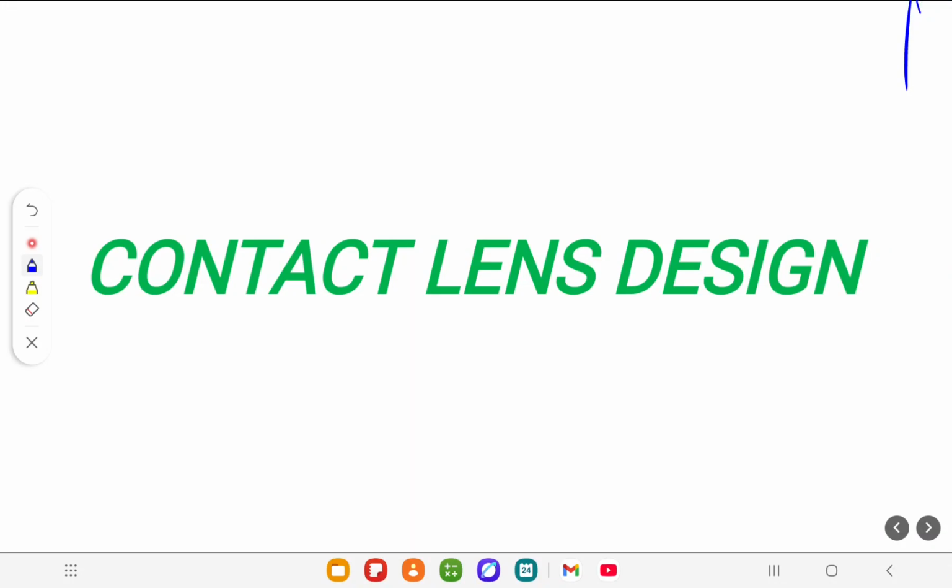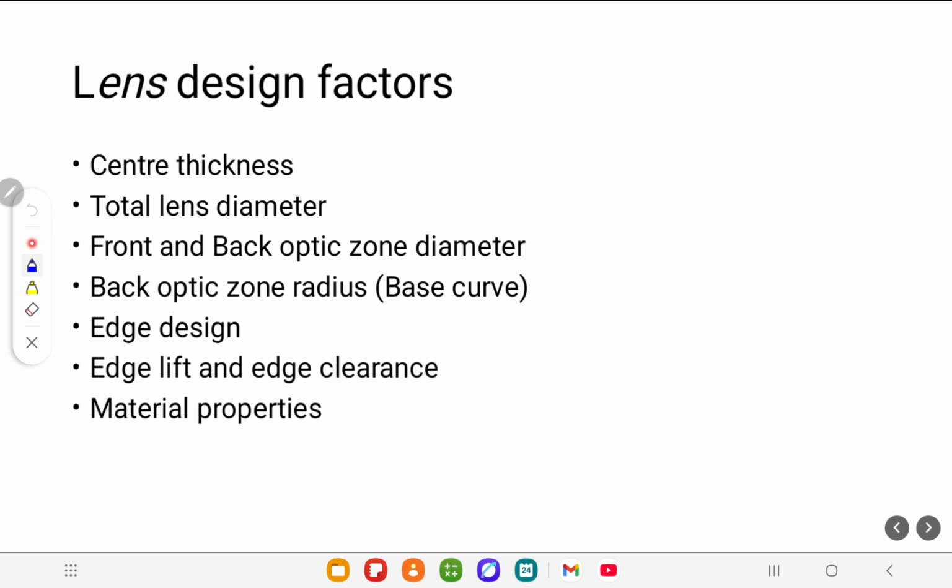Okay, let's start the video on contact lens design. We are definitely going to talk about these factors: central thickness, total diameter, front and back optic zone diameter, and back optic zone radius, which is commonly known as the base curve of the contact lens. One of the most important is edge design, in which we will talk about the shape of the edges and other factors, as well as what is edge lift and what is edge clearance.